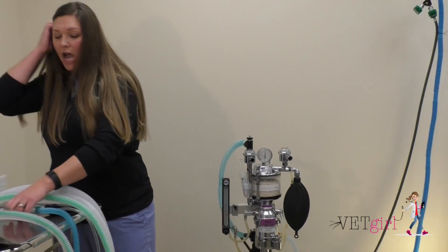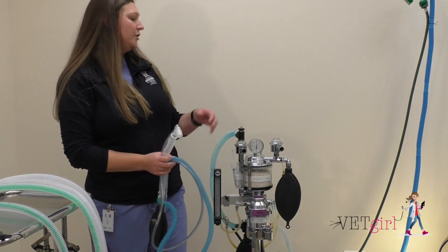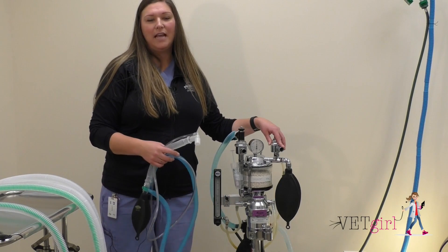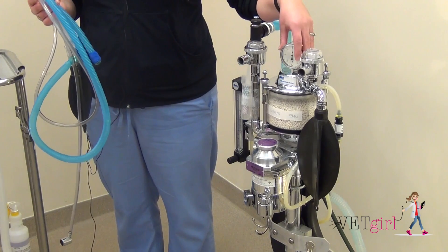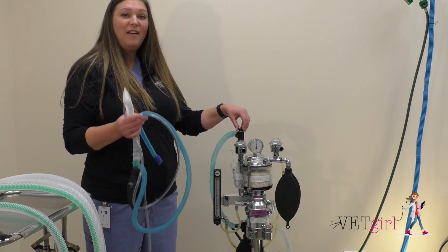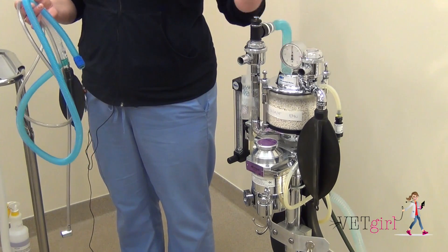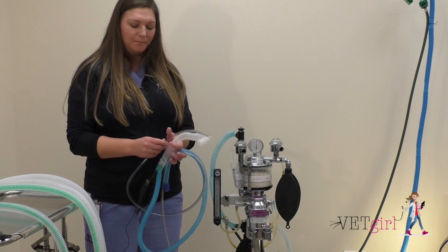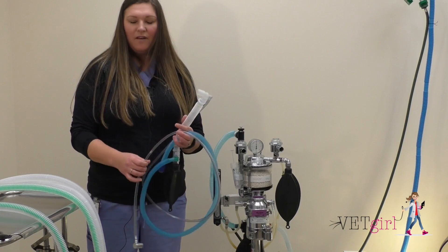Moving on to our second system: the non-rebreathing system. Non-rebreathing allows us to anesthetize patients that are too small to manipulate or move the flutter valves or the unidirectional valves to correctly pass exhaled CO2 and waste anesthetic gas into the re-breathing system. What the machine has done is remove resistance from the system. A non-rebreathing system excludes the unidirectional valves, the pop-off valve, and the sodalime canister. It functions solely on a high oxygen flow rate to flush or continually push exhaled gases back to the scavenge because the patient is too small to do so. Patients that utilize a non-rebreathing system are usually less than seven or eight kilograms; anything above that could go on a re-breathing system.